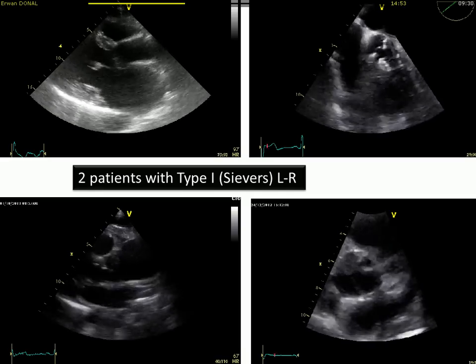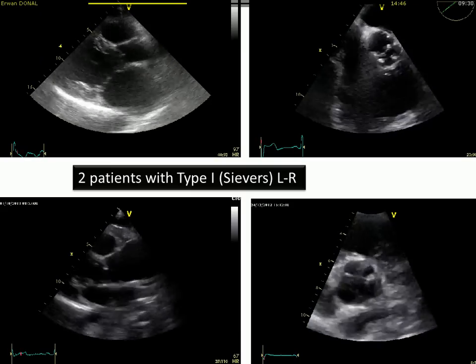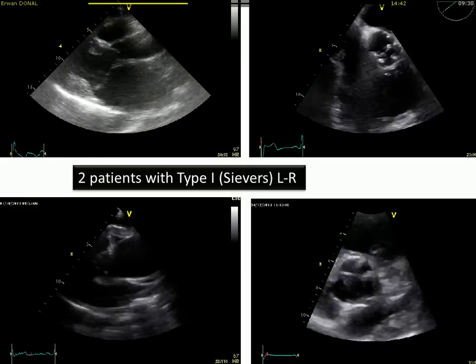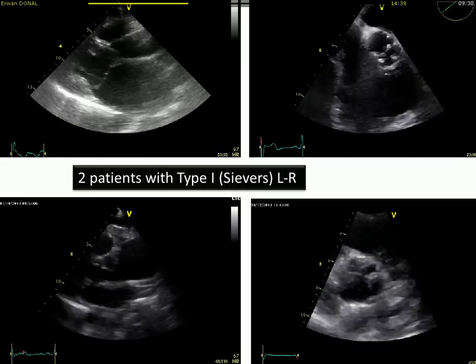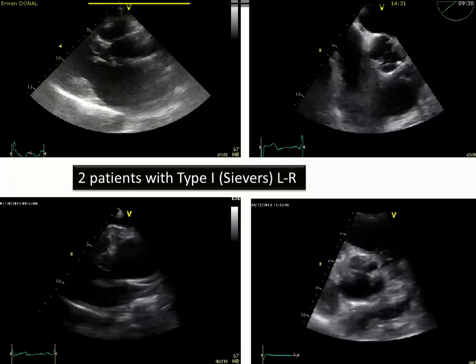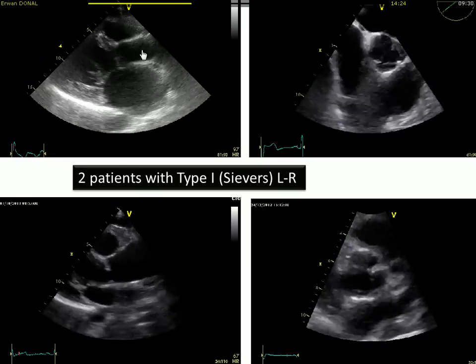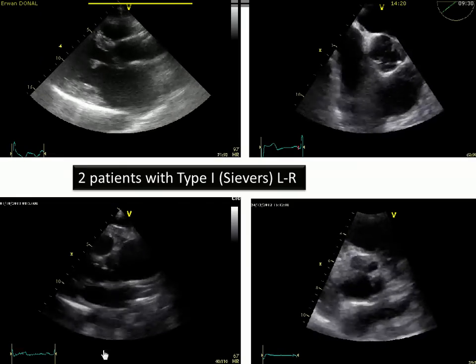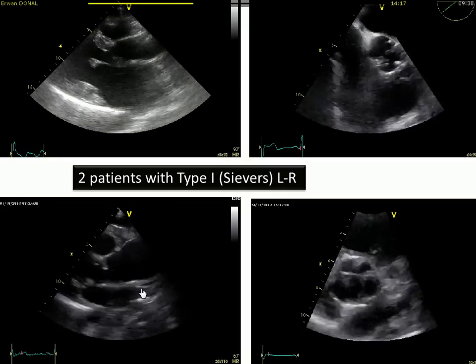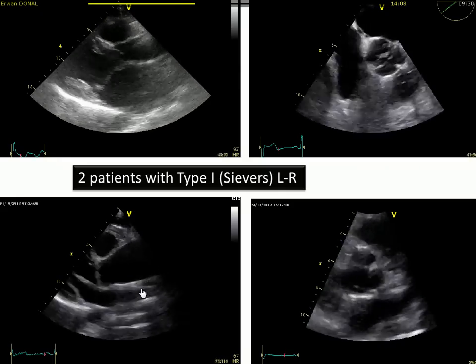It's very important to consider the fact that we start by echo, and we have also to provide to the patient another modality, because we have some strange history. We already saw some of them. I will just share with you these two patients. These two patients have a bicuspid aortic valve. These two patients have a raphe between the left and the right cusps.